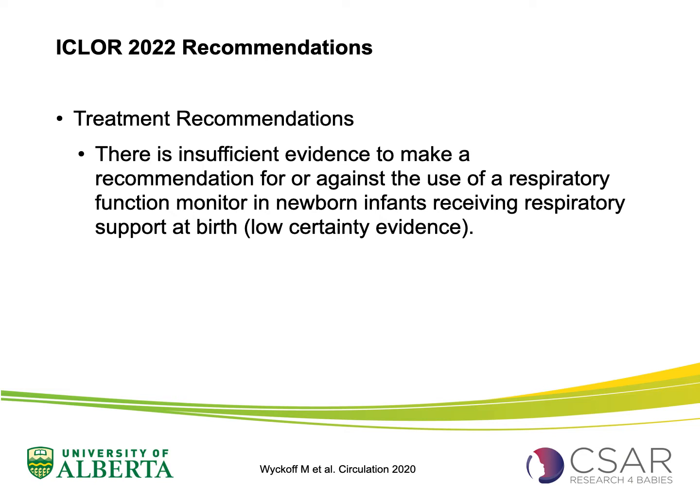This was just out for public comments, and the treatment recommendation for using a respiratory function monitor in 2022 hasn't changed from previous statements, where it says there is insufficient evidence to make a recommendation for or against the use of a respiratory function monitor in newborn infants receiving respiratory support at birth. There is low certainty of evidence. Now the question is, is that true? Is there anything ILCOR might have missed, or maybe we should use it, and we will discuss this in the next 20 minutes or so.